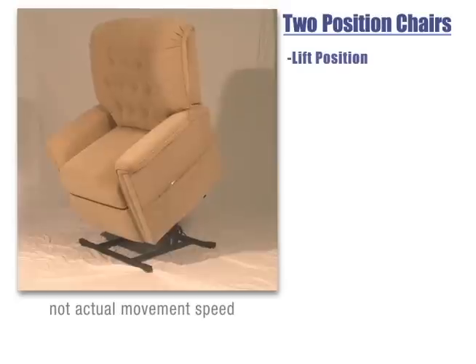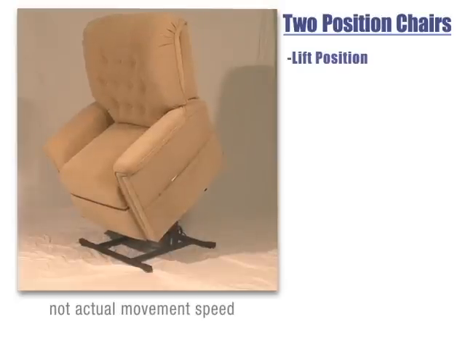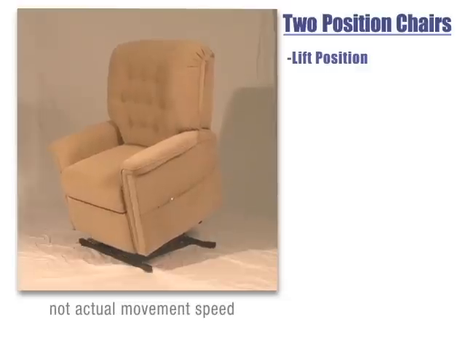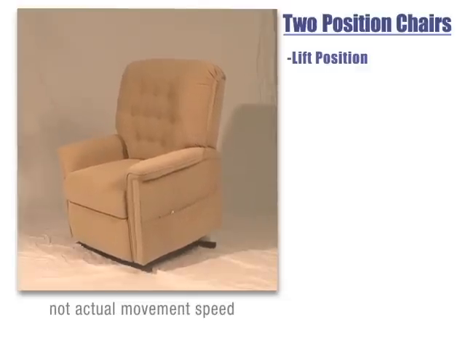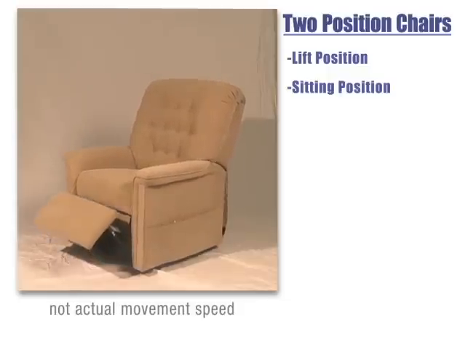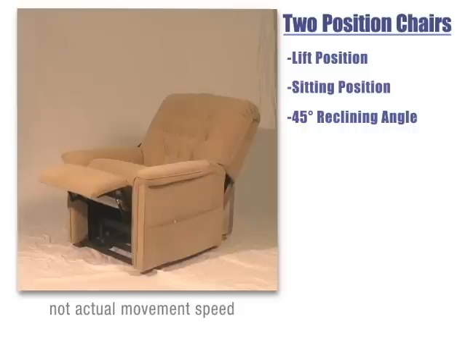The two position chair is able to lift a person, assisting those who may have difficulty standing from a seated position. With the push of a button, it goes back into a sitting position and is also able to recline 45 degrees for a comfortable reclining position.